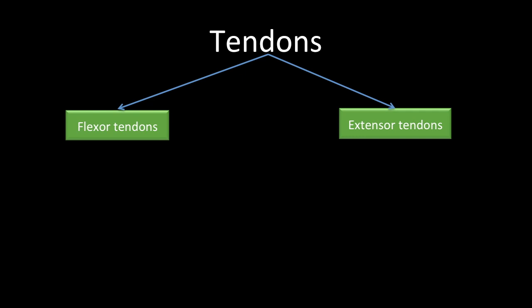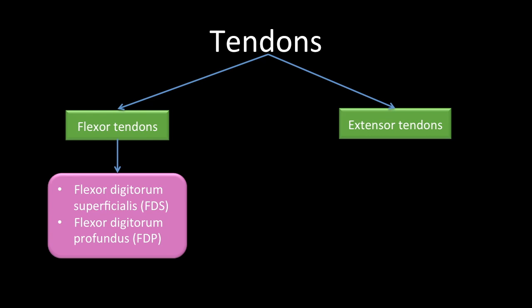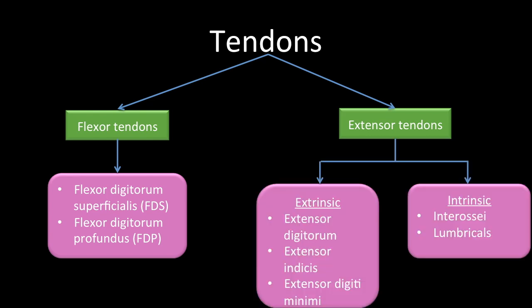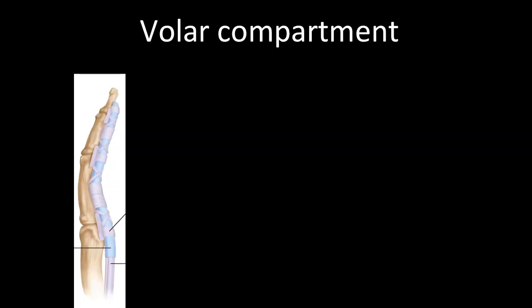Flexor tendons in the volar compartment include two: flexor digitorum superficialis and flexor digitorum profundus. Extensor tendons on the dorsal side are divided into extrinsic tendons — those originating outside the hand such as in the forearm or elbow — and intrinsic tendons originating within the hand. Extrinsic extensors include extensor digitorum, extensor indicis, and extensor digiti minimi. Intrinsic tendons include the interossei and lumbricals. The volar compartment image looks complex, so we'll break down each structure individually.